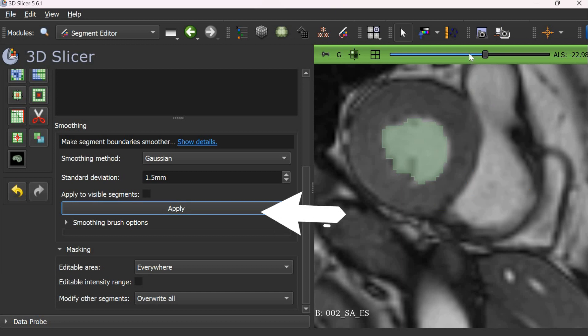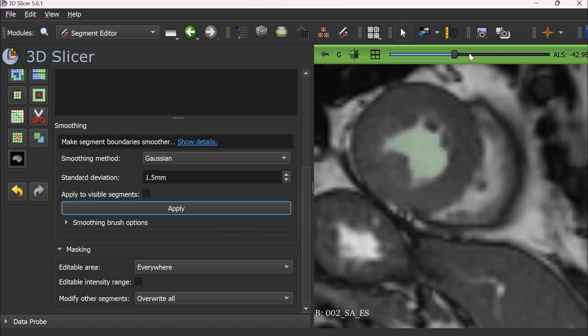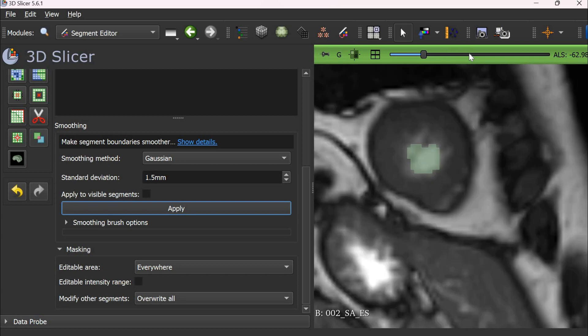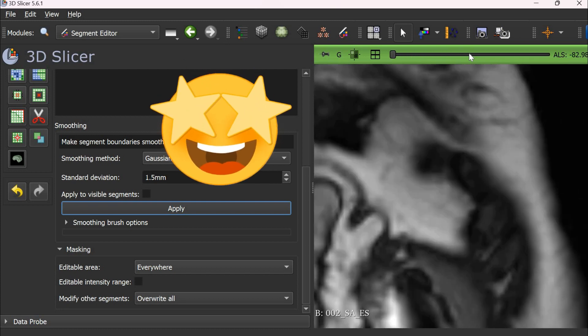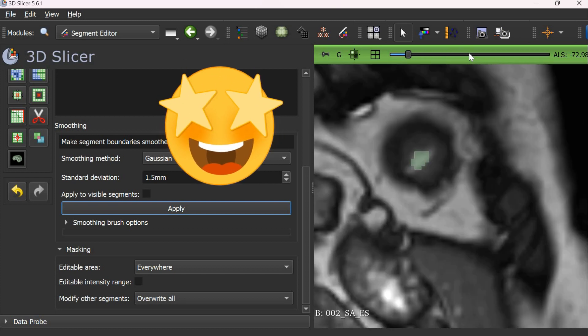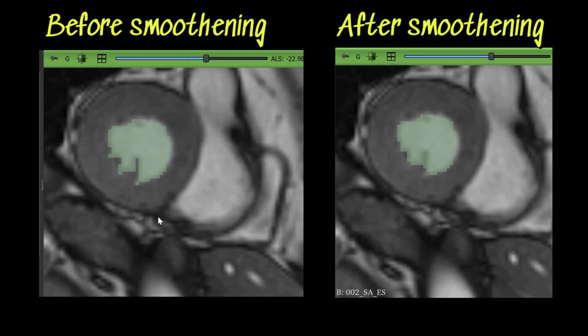And the beauty of this tool is that it will smoothen the entire stack of the slices, not only the current one.